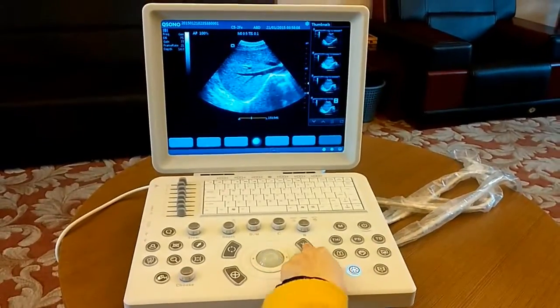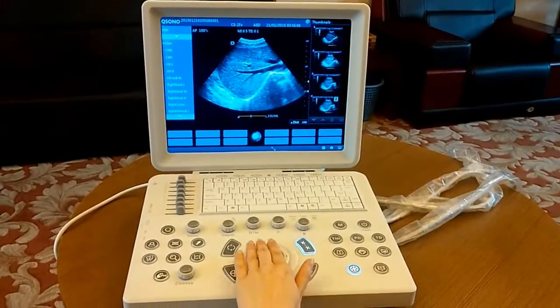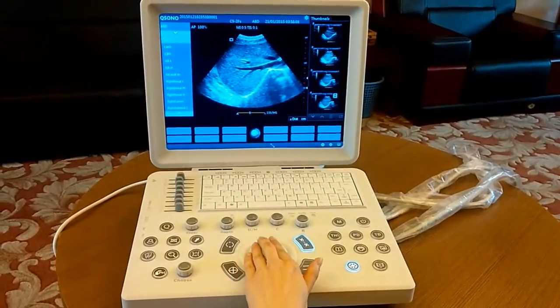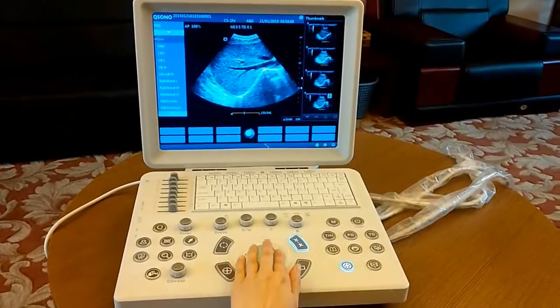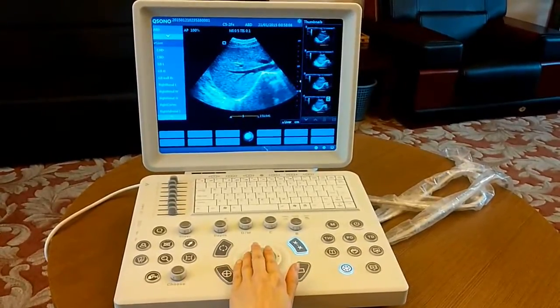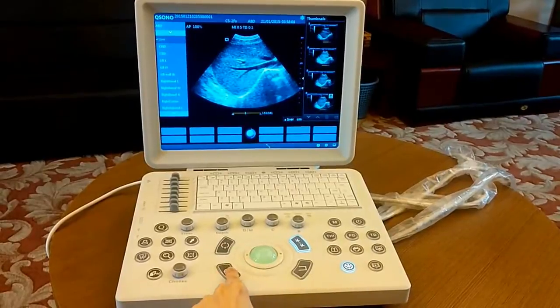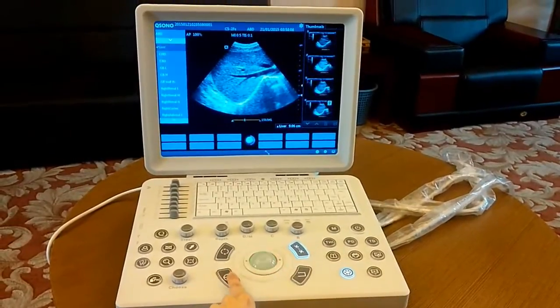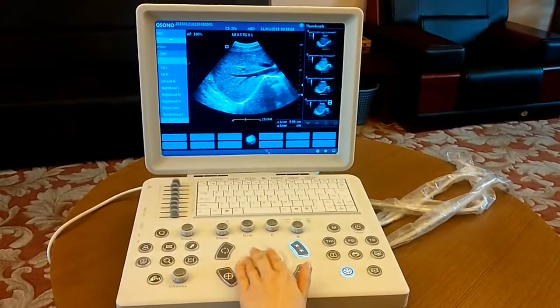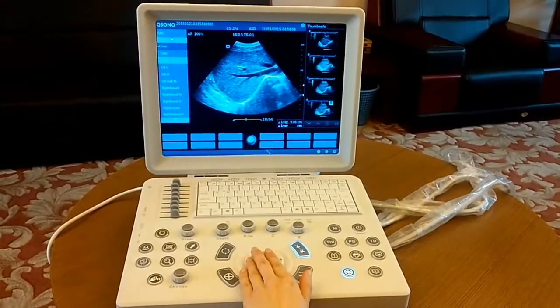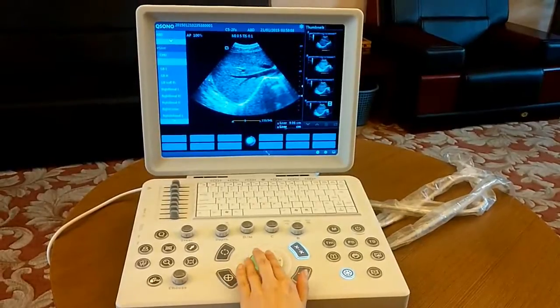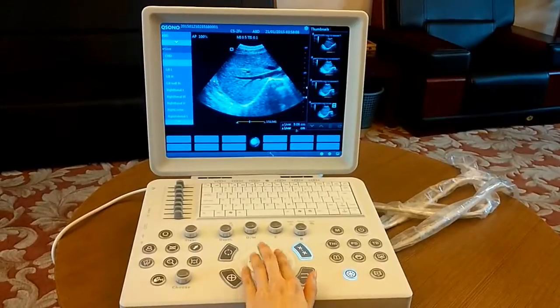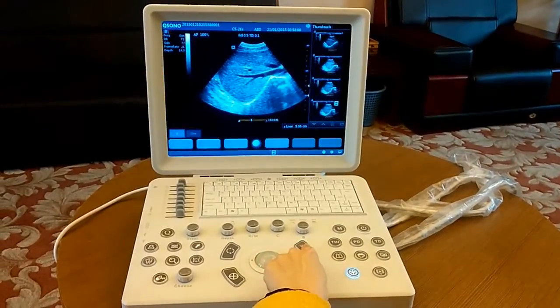Press the measurement button to enter the measurement function. Many measurement items for the current application are shown at the left of the screen for you to choose. Move the cursor to one point and press set to select it, then move to another point and press set again. Measurement information will be shown at the lower right corner of the image. Press the measurement button again to close the measurement function.